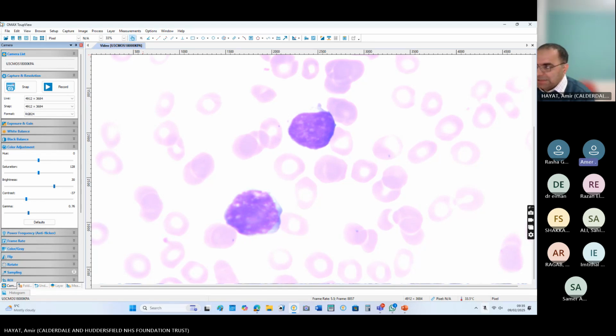When I mentioned to you the TdT is a marker of immaturity, it means this is acute leukemia. But on peripheral blood, you cannot say whether this is acute myeloid leukemia or acute lymphoblastic leukemia. You need peripheral blood flow for that, because things usually are deceiving on the peripheral blood film morphology. You may be thinking acute myeloid leukemia and it comes out as ALL. You may be thinking ALL, it comes out as AML. So we always trust the flow cytometry.